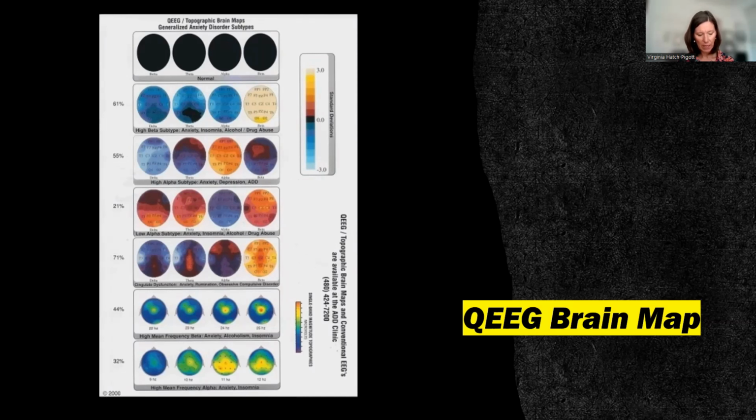If you look at the second row, each column is fairly normal except for the far right oval or head, which is light yellow. Okay, right here, second column. These all look essentially normal, but wow, look at this. This whole entire head is up here at 3 standard deviations of excess beta power.